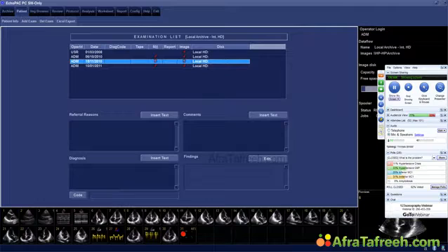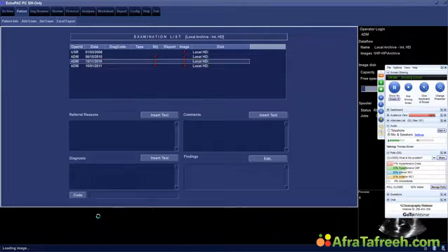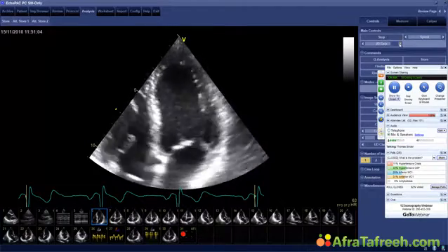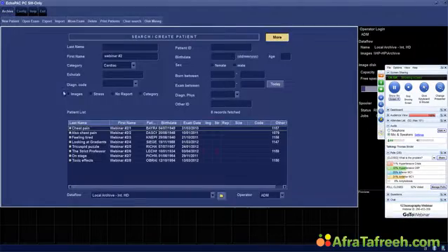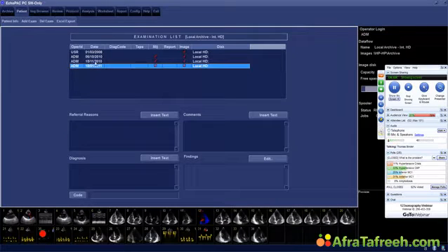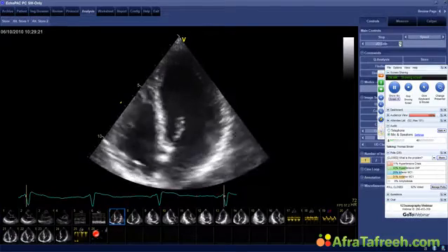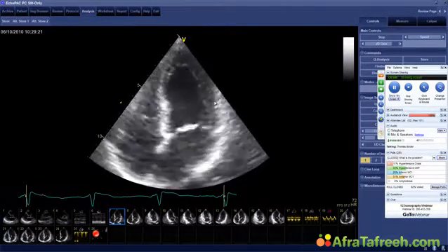And again, my question to you, does she have regional wall motion abnormalities or not? I will now, first of all, show you the images of the two-chamber view. Wait, just let me go back one more second. I think I want to show you something else first. Okay, I'll show you this image first. I think this is a bit clearer. Okay, so this is the echo we performed.